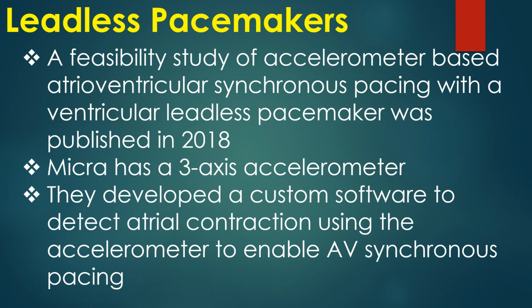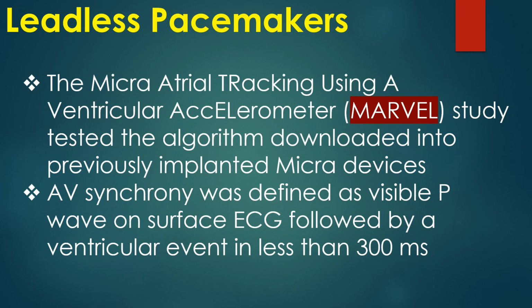A feasibility study of accelerometer-based atrioventricular synchronous pacing with a ventricular leadless pacemaker was published in 2018. Micra has a 3-axis accelerometer. They developed a custom software to detect atrial contraction using the accelerometer to enable AV synchronous pacing. The Marvel study tested the algorithm downloaded into previously implanted Micra devices.